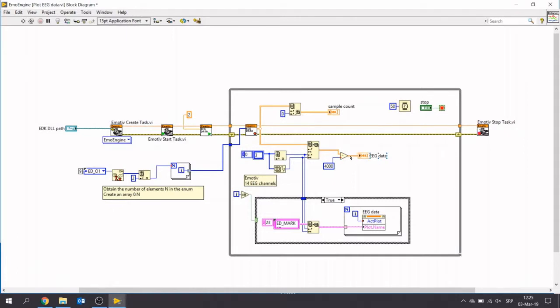After this, when we have the EEG data, we can do some analysis like detection of alpha waves or spectrum analysis, whatever we need. But this is the first step for creating that kind of application.